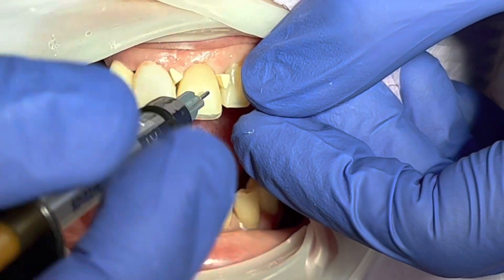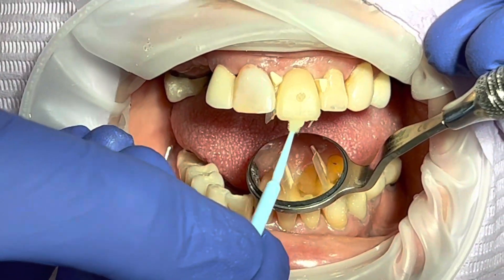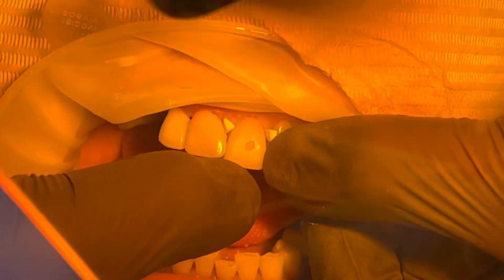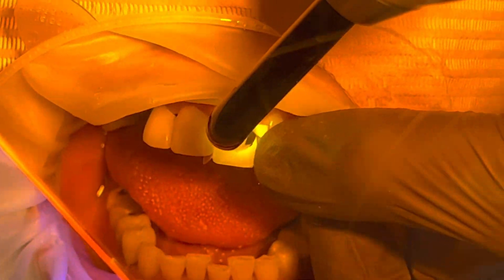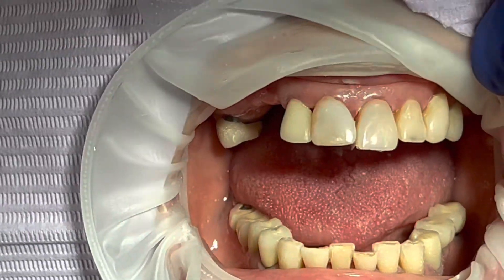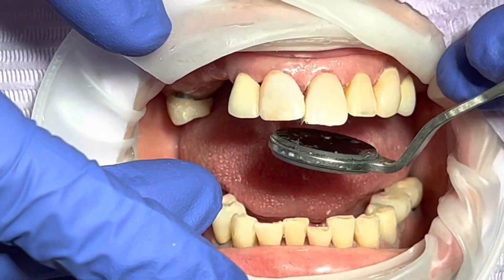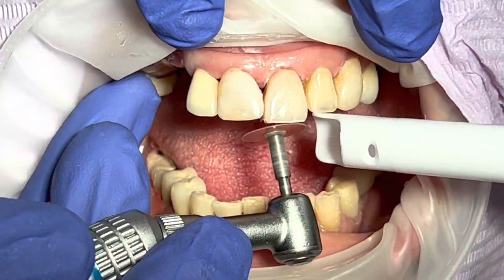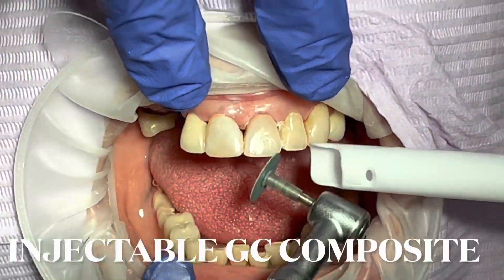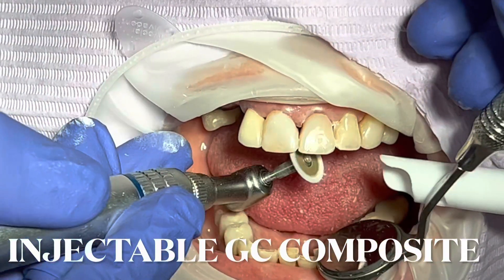I inject this GC injectable composite material into the template. It's not a flowable composite — it's an injectable, which has a high concentration of resin with nanotechnology that is just as strong as regular composite. You can actually melt regular composite paste and inject it into the injectable syringe and use it similarly. This is the GC injectable composite nanotechnology — not a flowable composite. Those of you watching, don't get scared thinking it might break.